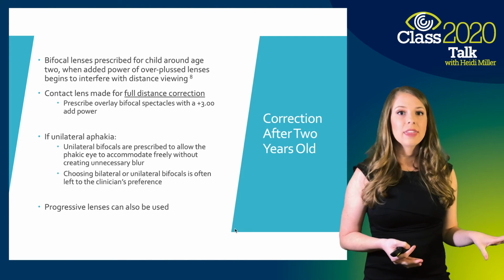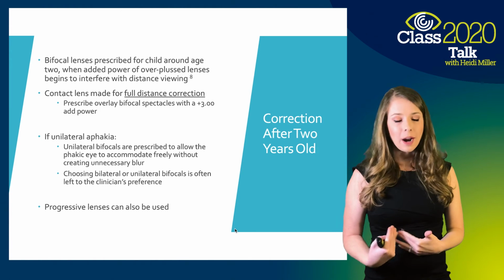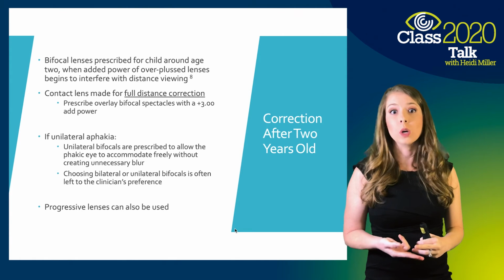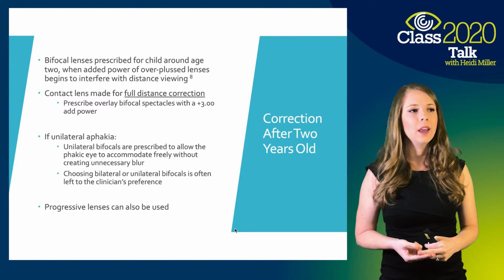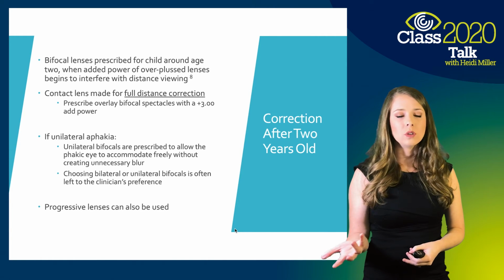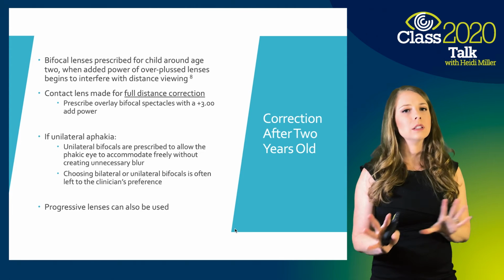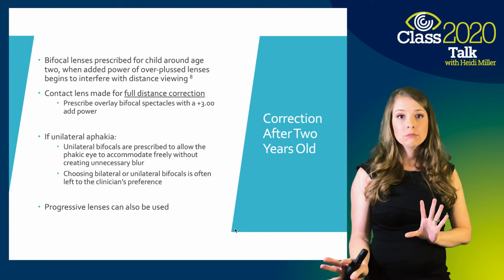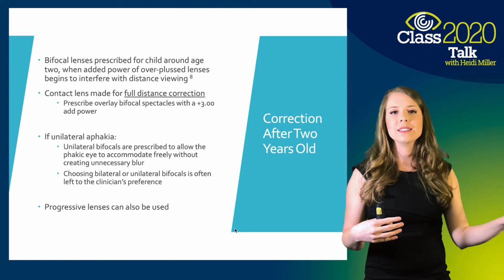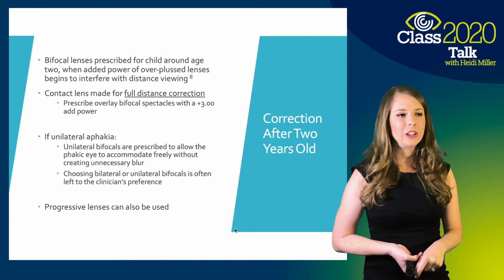I will say that progressives are a possibility. However, not my preference, but I do work with 2 different pediatric ophthalmologists at my office, and one of them really prefers progressives and the other one prefers segmented bifocals. And so because I'm in a co-management setting, I do try to tailor a little bit to the doctor's style just so that we're not changing lenses just because of the preference of the ophthalmologist.